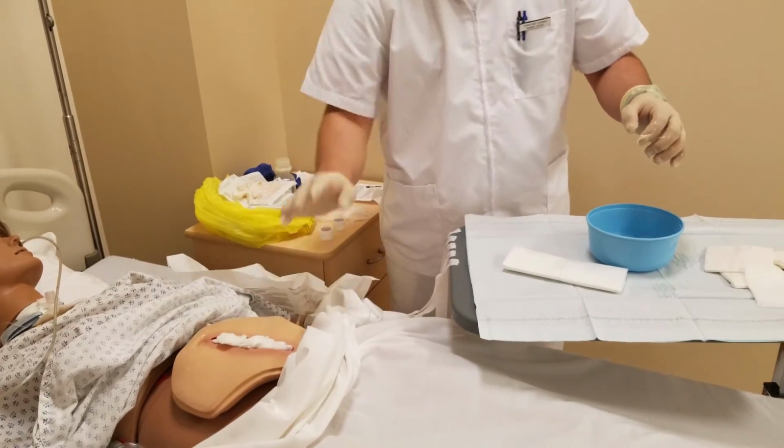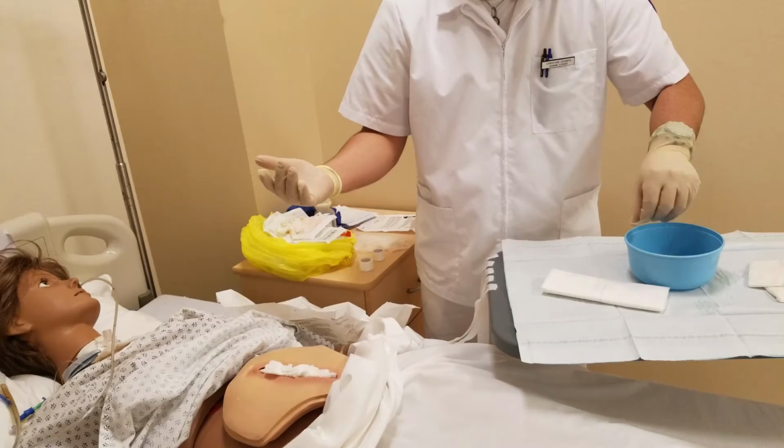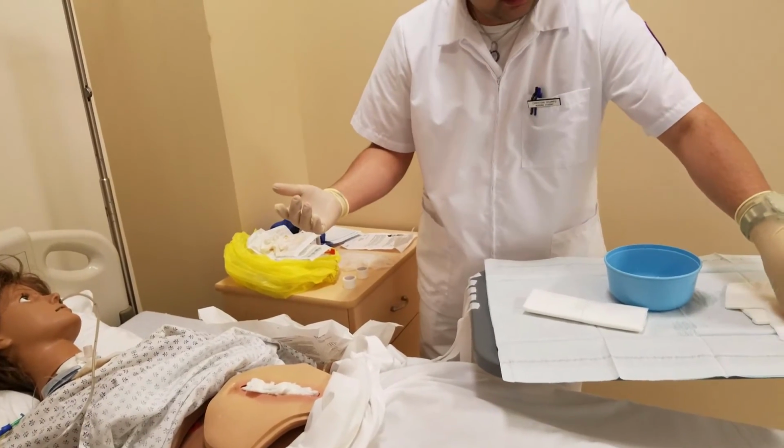Now, once we're happy with that, we're gonna take some dry gauze, I'm just gonna get clean gauze, not wet gauze.